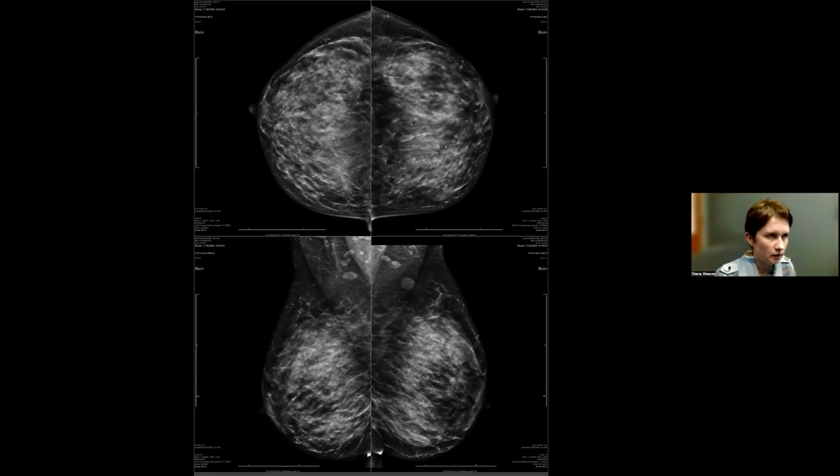So this is a PACS approach. This is a woman with dense breasts and multiple bilateral masses. The masses are fluctuating in size and number over the years, which is consistent with the changing pattern of cysts. But every time the woman comes and a new mass appears, it might be challenging to easily dismiss it. So in this case, on top are low energy images for this woman with extremely dense or heterogeneously dense breasts and multiple masses.